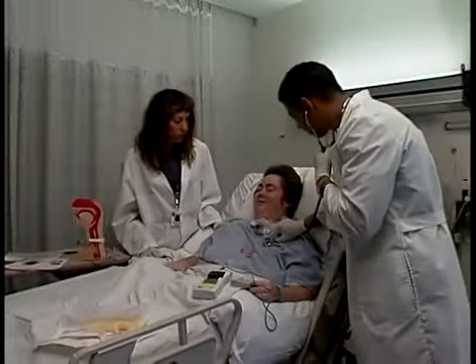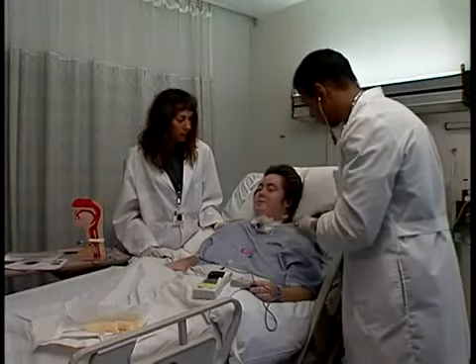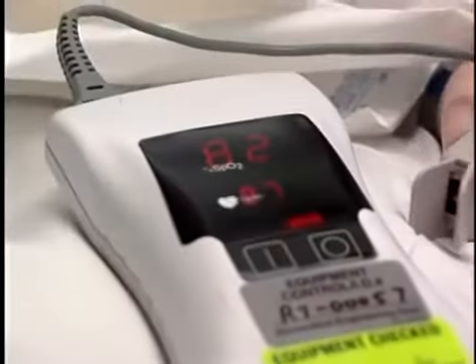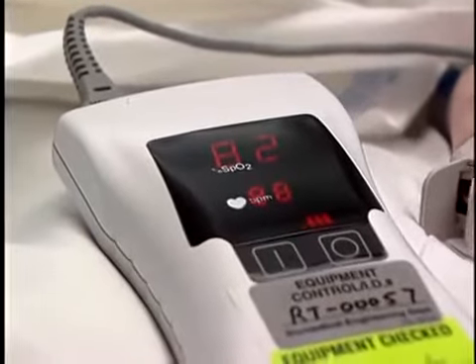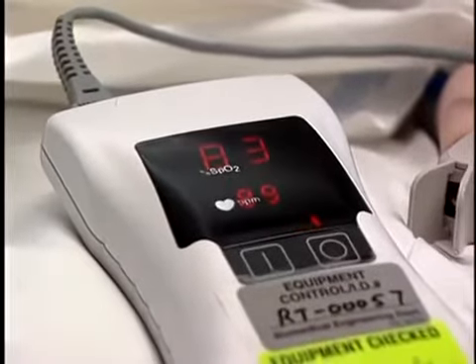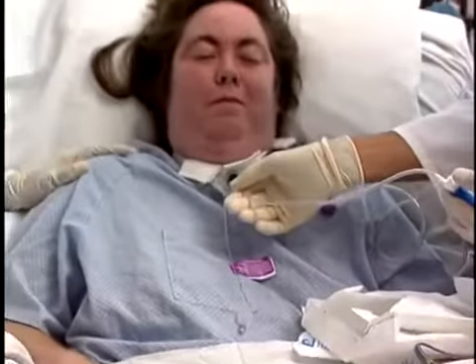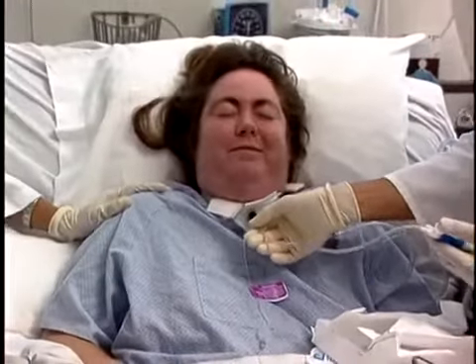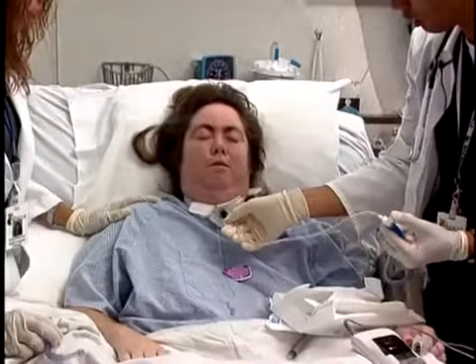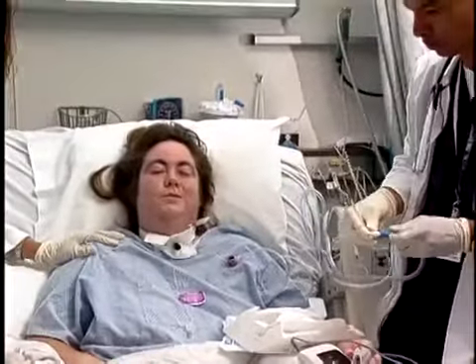The baseline measurements described earlier should be carefully monitored for significant changes while the patient is wearing the valve. If significant negative changes are observed, remove the valve immediately. If the patient experiences difficulty utilizing the valve, there may be airway obstruction, possibly due to stenosis, masses, secretions, or a tracheostomy tube that is oversized for the patient's trachea. With correction of the obstruction, the valve can once again be used.